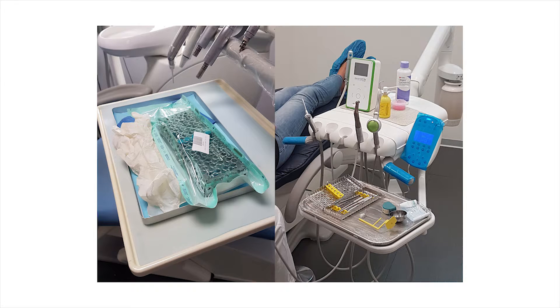It's nice to be able to just ask for the X kit and have it brought out in front of the patient, unwrapped in front of them, and they can see that everything is nice and clean and gleaming.